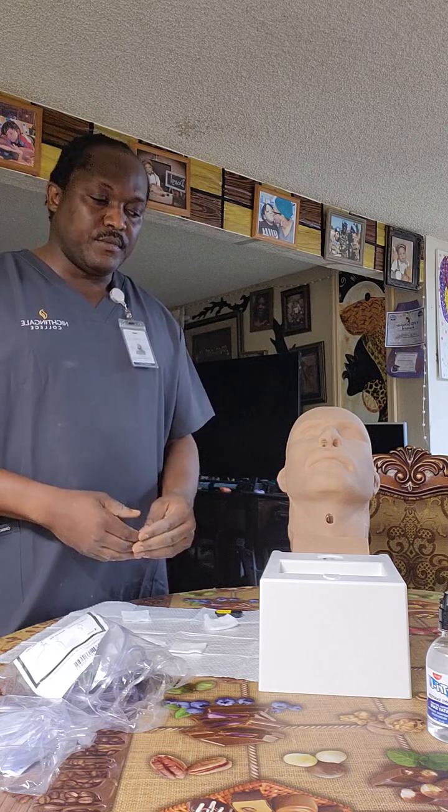I knocked, I came in, I introduced myself to the patient, and I identified him with 2 forms of identification, his name and his date of birth. And I told him that the doctor has put in an order for us to administer oxygen because his oxygen levels are very low. So I'm going to begin with the nasal cannula.